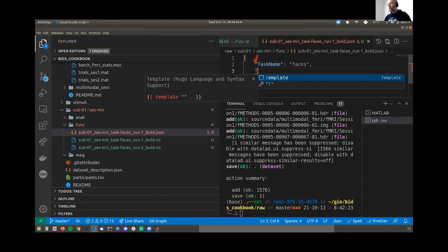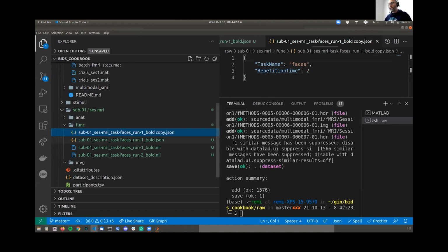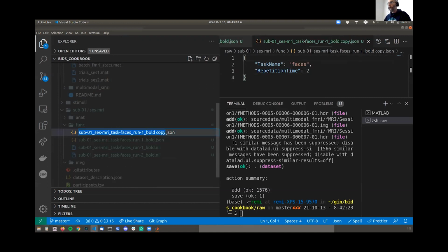I'm pretty sure that we also have repetition time, just like this. And it was a 2 seconds repetition time. Cool. Let's create a copy of this because we need one for run number 2.